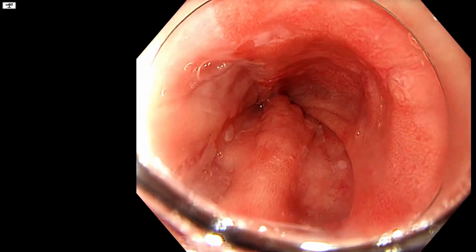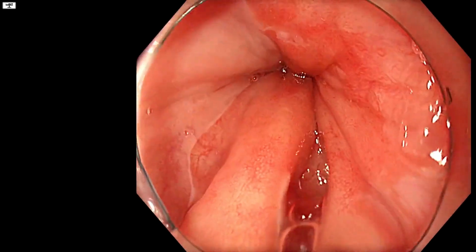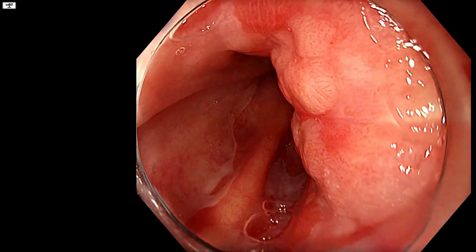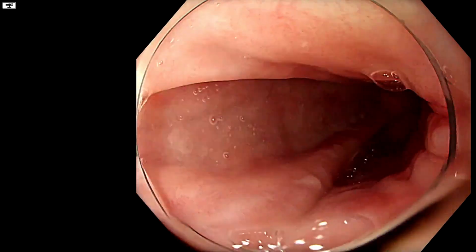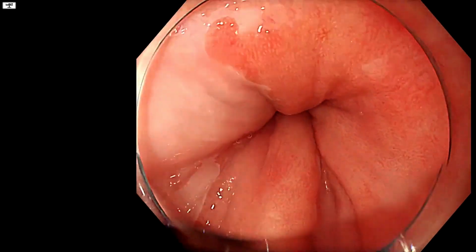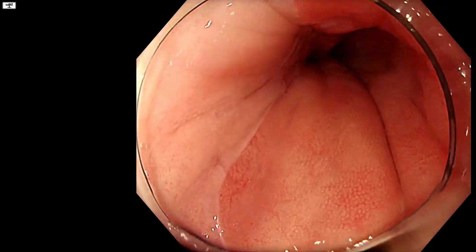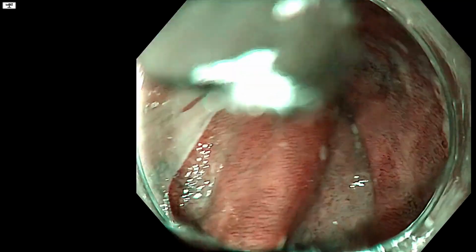So the person who detected this took a biopsy of this nodular zone here at the top. So if we come back here at the 3 o'clock and coming back, this zone was biopsied as squamous dysplasia. And so actually you don't commonly see this. More commonly it's a little higher up. It's not usually associated with Barrett's esophagus, squamous dysplasia, and it's very hard to see in white light.